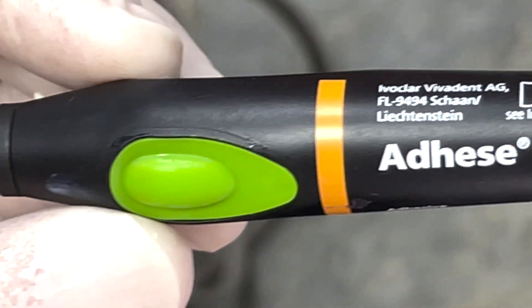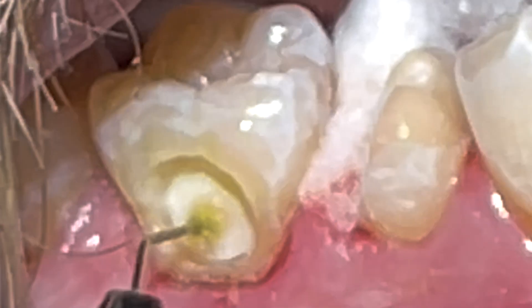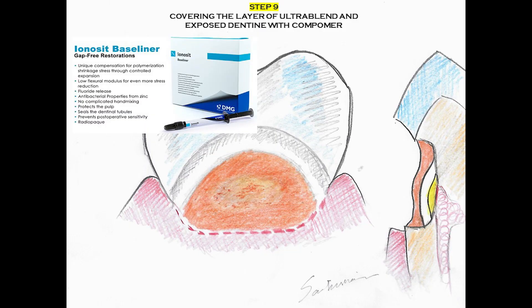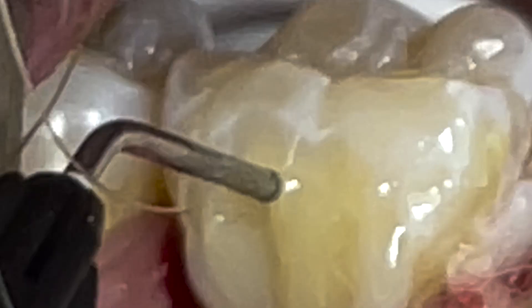On top of which, we apply a layer of Compomer, and then we complete our composite by adding layer after layer of flowable composite. Of course, that is a matter of choice — it could be some flowable sandwiched under proper packable composite. I find flowable a little easier to work with, and I can also work with different shade systems.